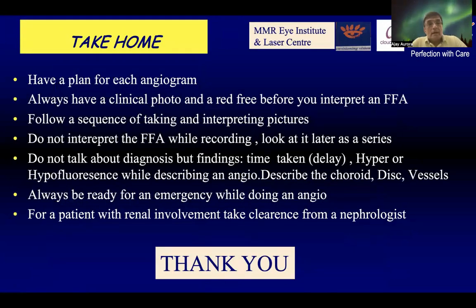Now, whenever we're doing angiography, you must have a plan for each angiogram. Always have a clinical photograph and a red-free photograph before you interpret an angiogram. You must follow a sequence of taking the pictures. Do not interpret the angiogram while recording. Look at it later as a series.